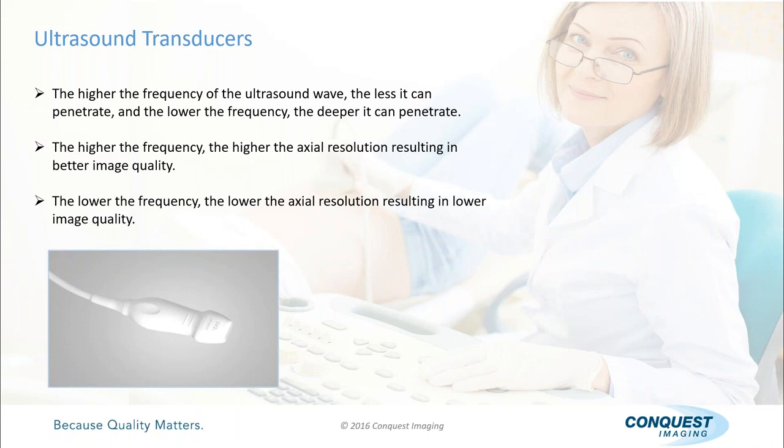But it's a principle that we have to be aware of. Then they have the lower frequency probes, which is down in the 1 megahertz range. So traditional ultrasound frequencies run from about 1 megahertz to 20 megahertz. When they get above 20 megahertz, they become very specialized. Okay, so 1 to 20 is a really good kind of characteristic of ultrasound probes. And the lower the frequency, the more they can penetrate, but the poorer resolution they have.